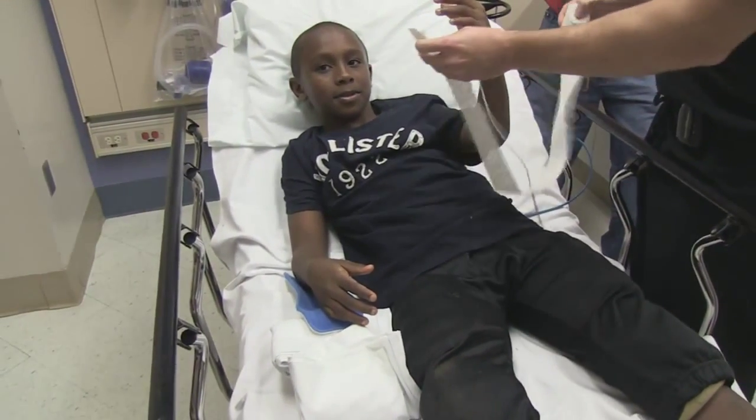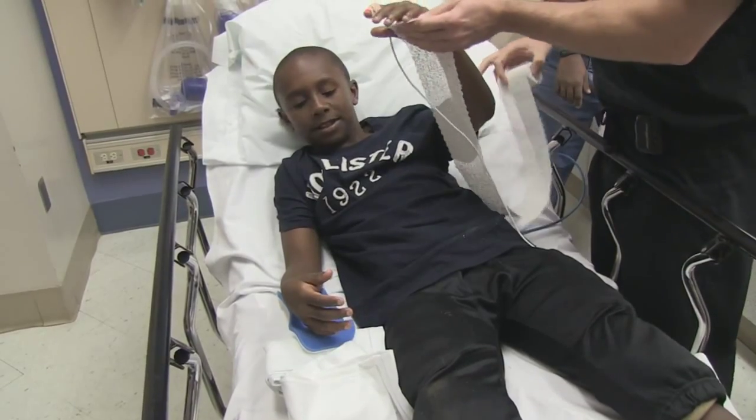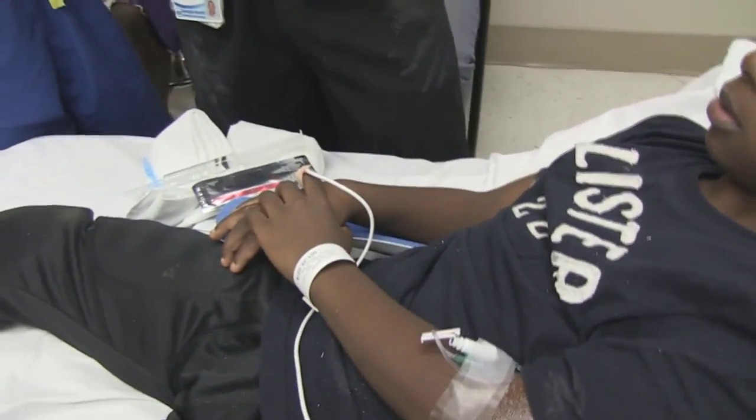You fell on your hand like that, or how'd you fall? On your wrist? You fell on your wrist? Just a little bee sting, all right? Just gonna be a little bee sting, okay?